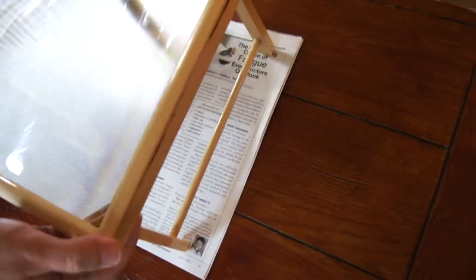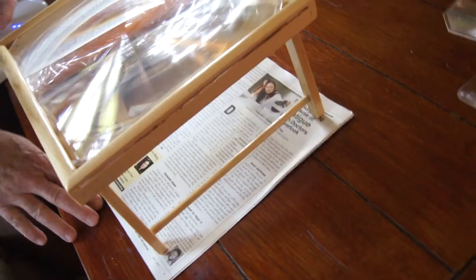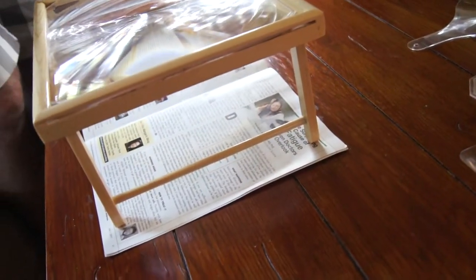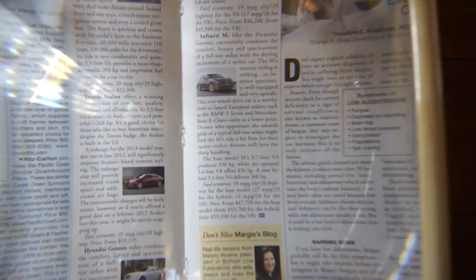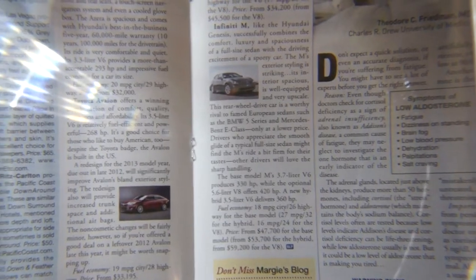As you can see, it's pre-focus — it rests right over the page so you don't have to focus whatsoever. It's approximately 3x, it's rigid, and it has probably the best light resolution on the market.